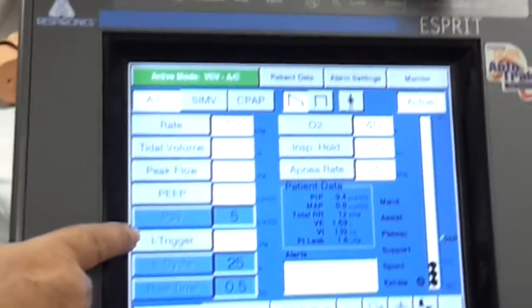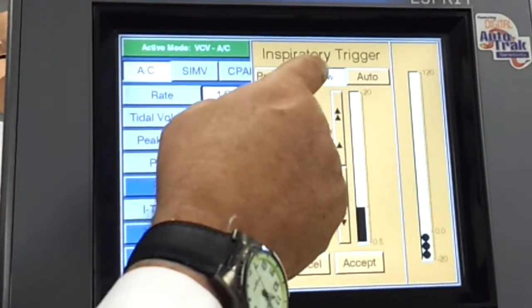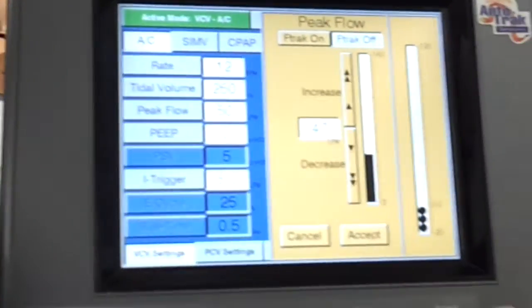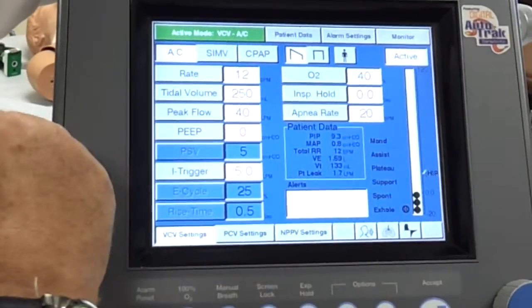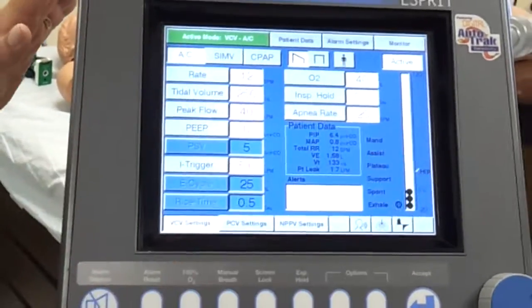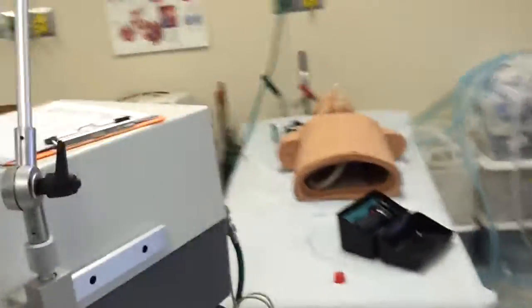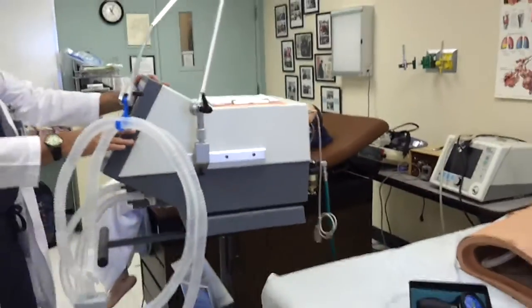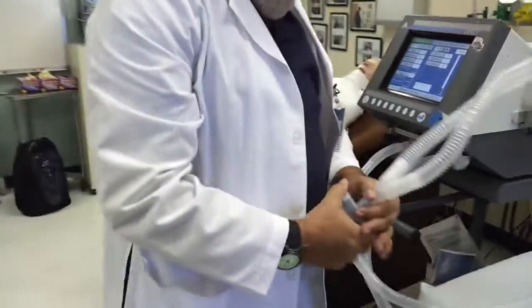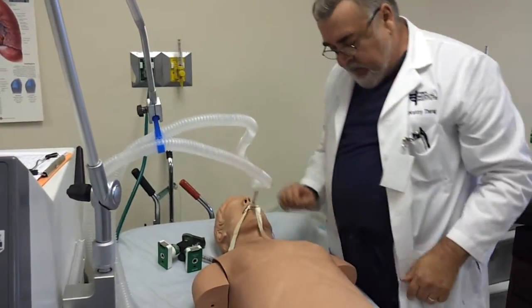Now I want to look at my sensitivity. It's set to I-trigger. On the Esprit you can either do pressure or flow sensitivity. It's better to do flow if you have the chance, so we'll do flow. Five liters is good, so just hit accept. Peak flow is set at 50 — let's lower that down to 40. That should be all our settings. Our apnea interval is 20 seconds like it should be. So now we've got all our settings in the ventilator. What I'm going to do next is attach it to the patient before I put in my alarm settings, because I want my alarms to be keyed to the patient values. I wait and see that the dummy's breathing.